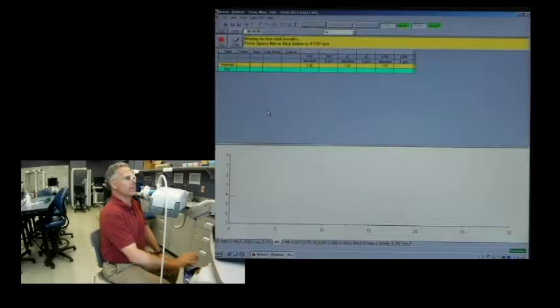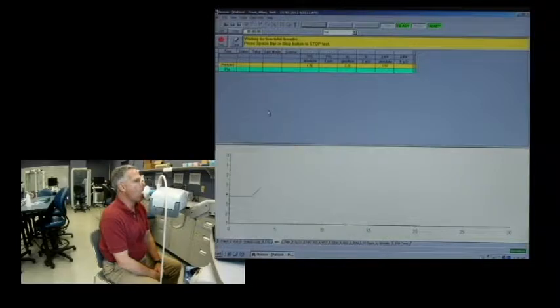Okay, let's try that with a patient. So we'll get them on there. Now just nice, easy breathing. You can see on our graphs there, we've got inspiration going up, and exhalation. Going to let them get a nice, easy breathing going on here. That shows us a good baseline now. Okay, next breath in, we're going to take a big breath in, as big as we can. Big. Come on, big breath in. Hold it, keep big breath in and blow it out. Keep blowing it all out now. Keep blowing. And now take a nice big breath in and relax. There we are, we're all done. Our first slow vital capacity maneuver.